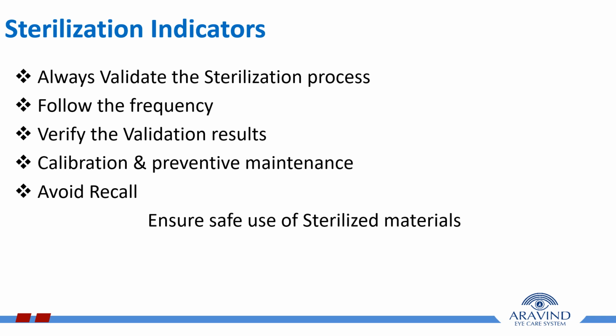So always validate the sterilization process, follow the frequency, verify the validation results, and complete the calibration and preventive maintenance schedule, to avoid recall and ensure safe use of sterilized materials.